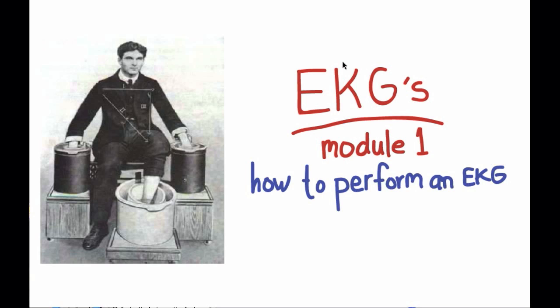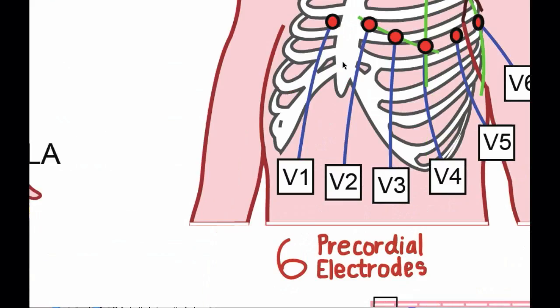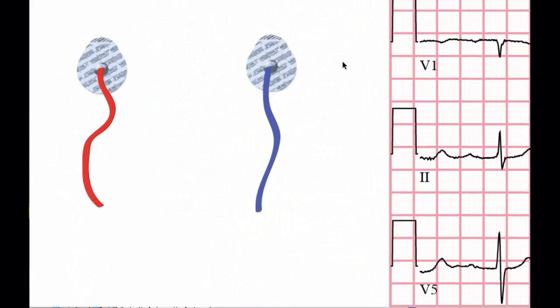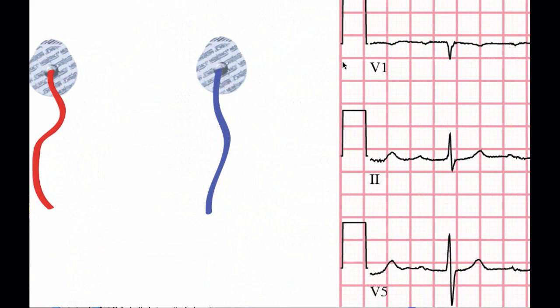The first distinction we should make is between the electrodes and leads. This is an electrode, and this is a lead. Electrodes are the actual physical cables and sticky gel pads that you put on a patient. A lead is a tracing of the electrical current of a patient's cardiac activity.